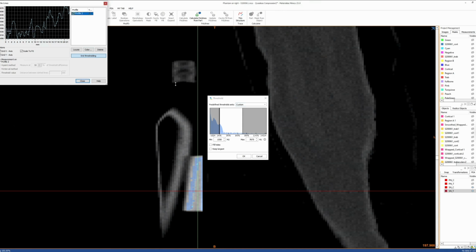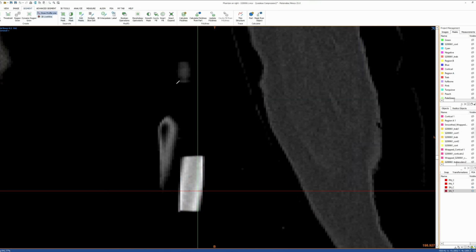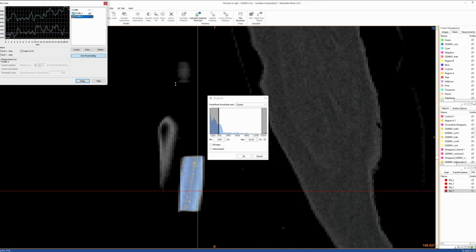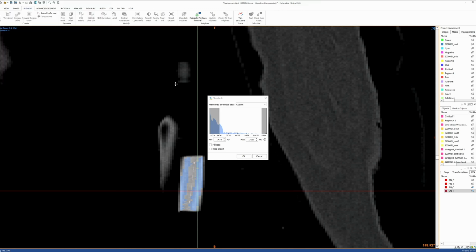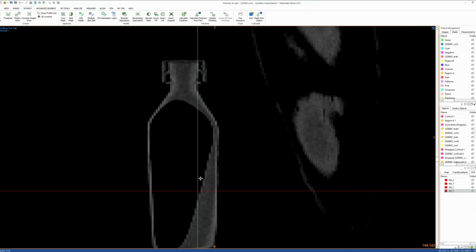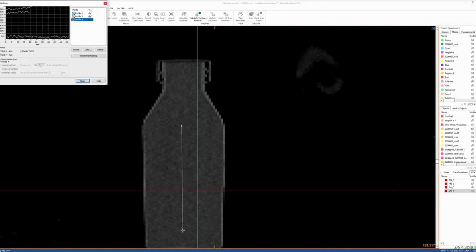Right here, I'm thresholding a line using the Draw Threshold Line tool in Mimics to identify what average density is associated with the Hounsfield units of the cortical bone block. Here, I'm merely repeating the same process, but this time while using the water phantom.